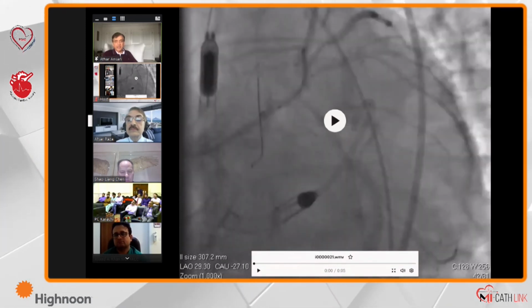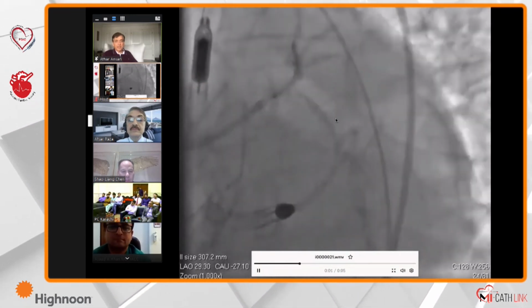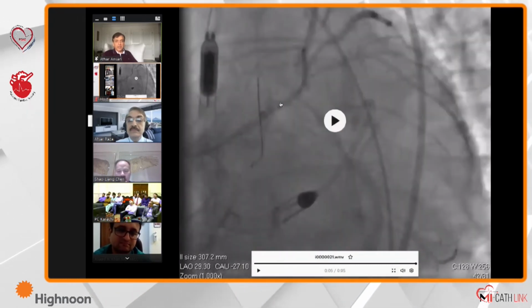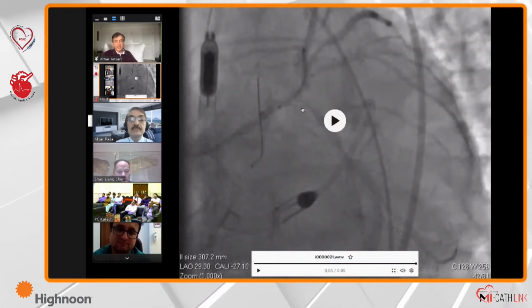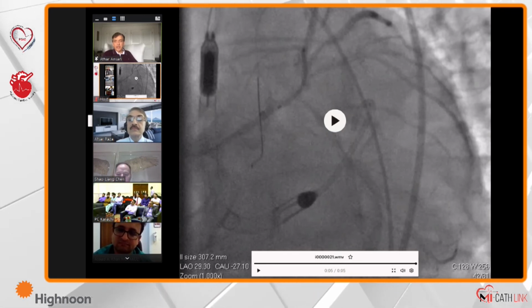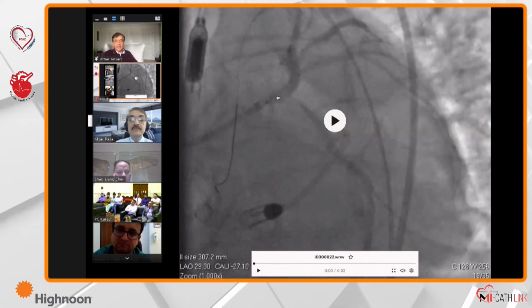And next, followed by the delivering of the stent. The stent is into the left main to the LAD, covering the circumflex. Now, remember, the circumflex has been pre-dilated. So I was pretty confident that I can do what we did in this case by Dr. Engrid. So here we go. And this is the stent deployed. Next patient.